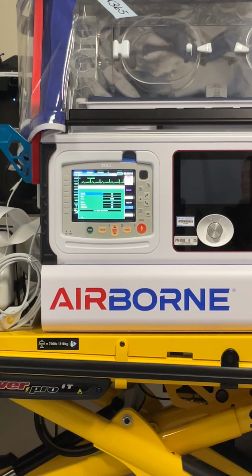We can change this to make it do daylight savings? No, if you turn on clock sync, you still have to adjust for daylight savings time. You have to tell the device it's on or off, otherwise you're going to be off by an hour.